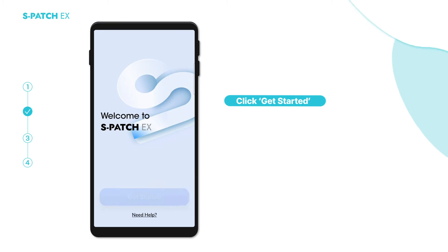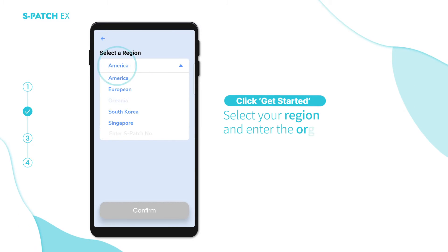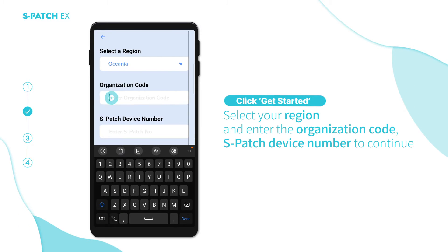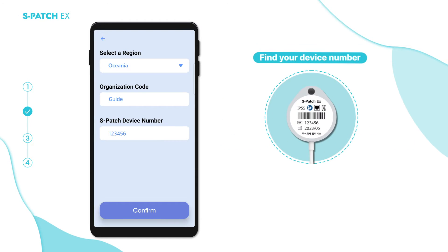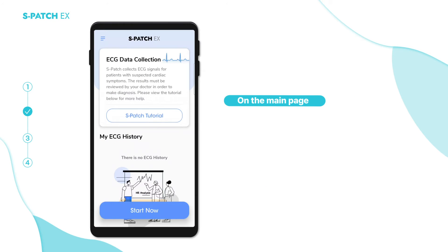Click Get Started, select your region, and enter the organization code and S Patch device number to continue. You can find your device number on the back of the S Patch device or on the device box.